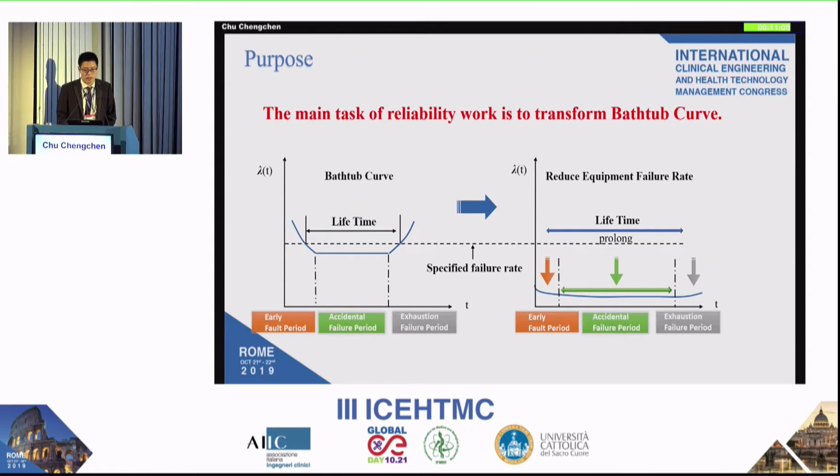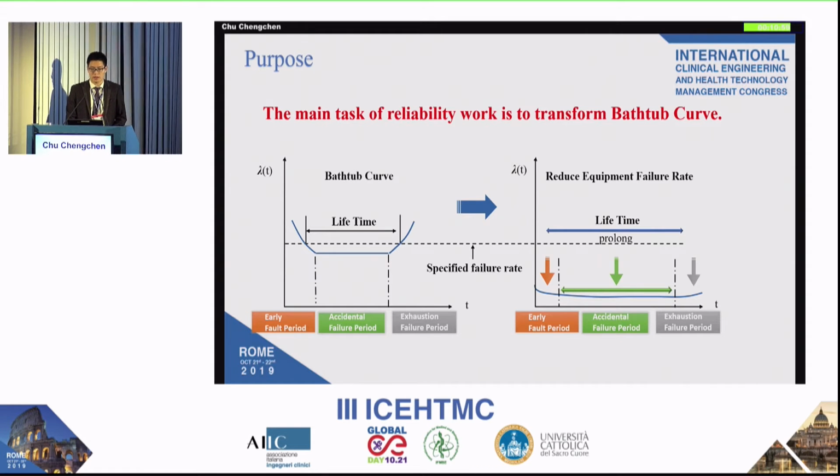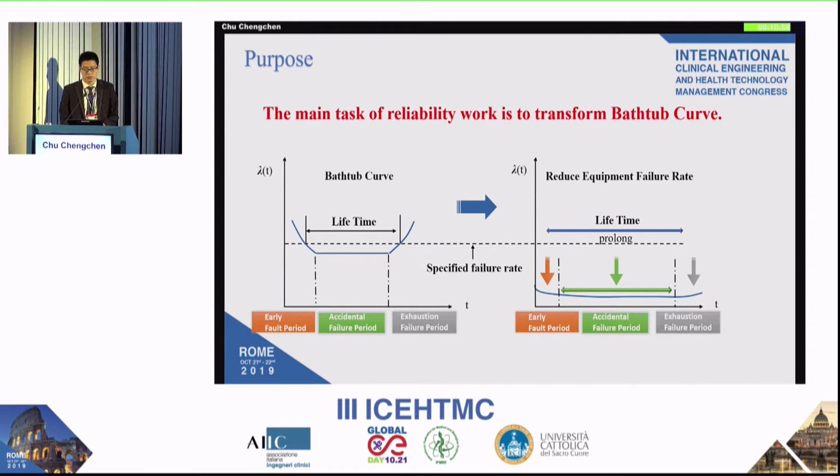This slide shows that in most products, the curve of the failure rate resembles a bathtub, called the bathtub curve. The change of the failure rate of most products can be divided into 3 periods.